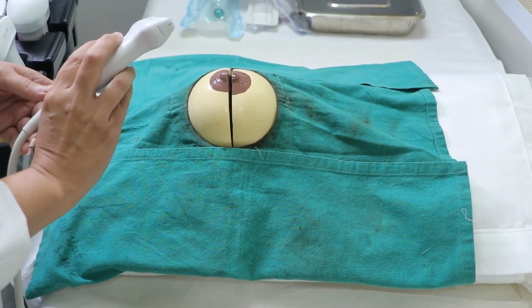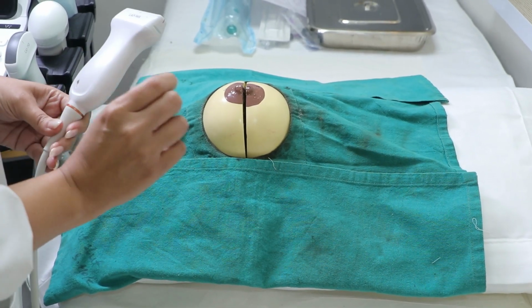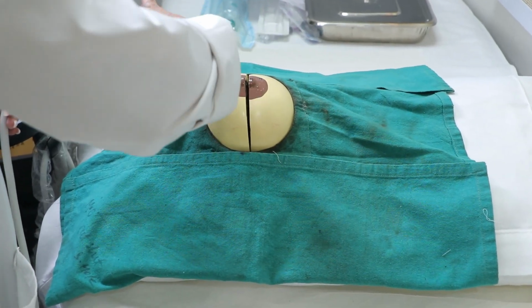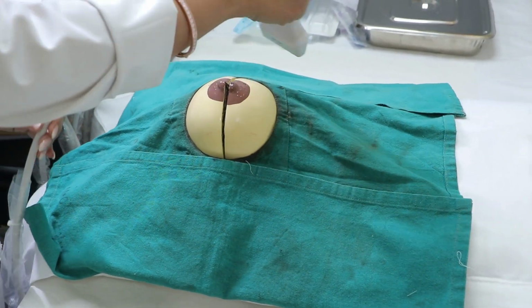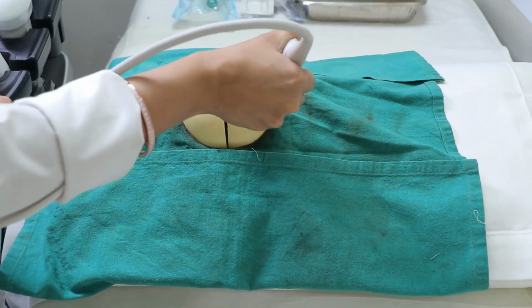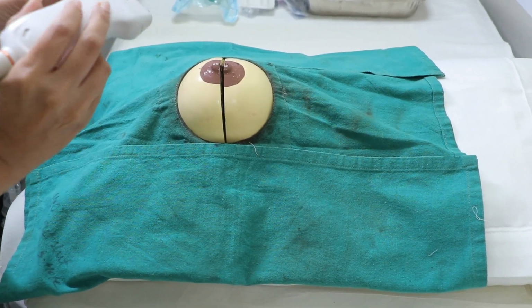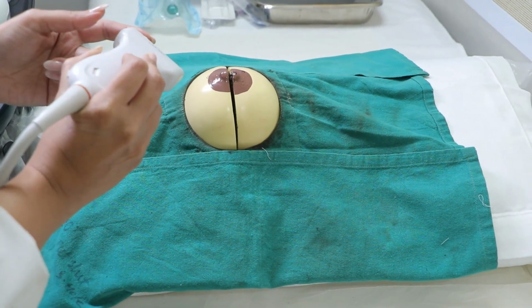There are various ways to do the breast ultrasound. Number one is that we go radial. Radial means that we are at a tangent of this. This is the radial position. We'll go from the outer to the inner part like that, clockwise. This is called radial ultrasound position. Make sure that your right is correct towards the right of the patient, towards your right hand, which is left of the screen.